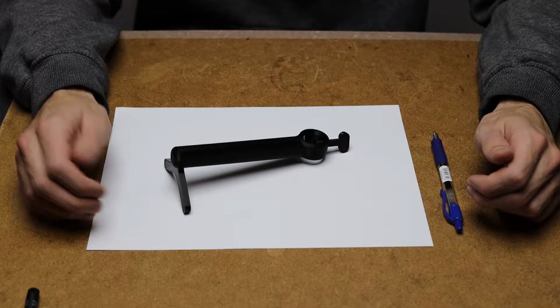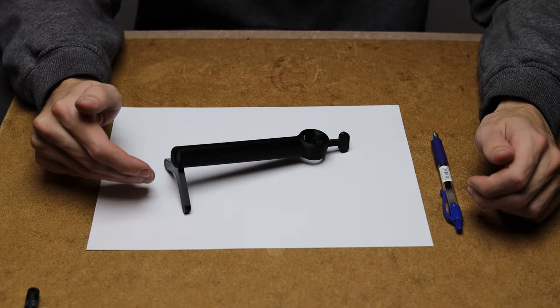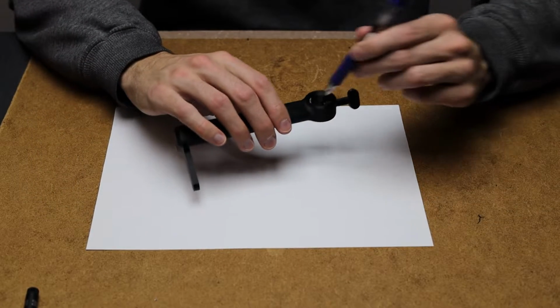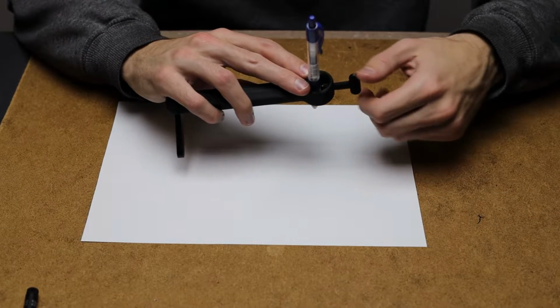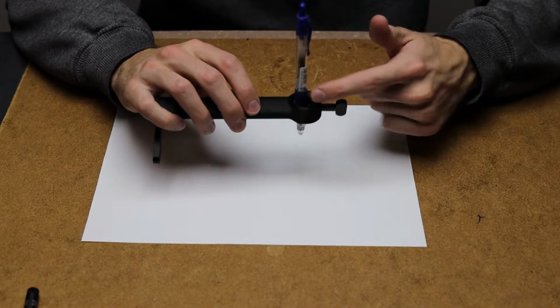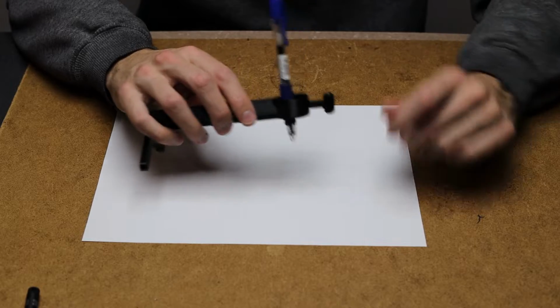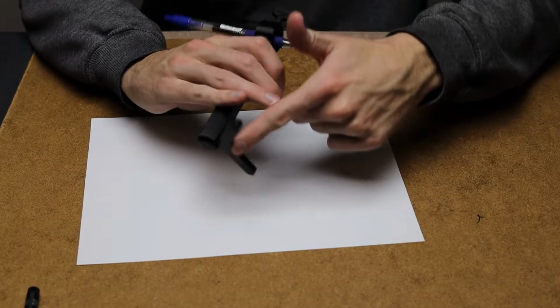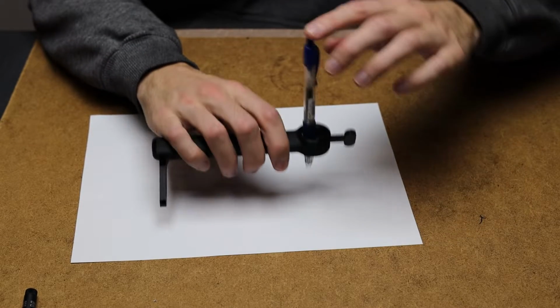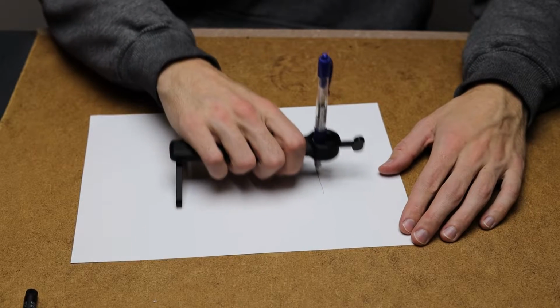In this video, we will show how to assemble a penholder. This is a product that can help you stabilize your hand if you have to write with a pen or pencil. You simply insert the pen into the hole, tighten the screw. You have a support that can be screwed on and off. You can then activate it and write.